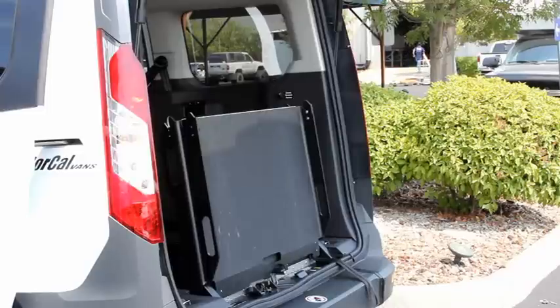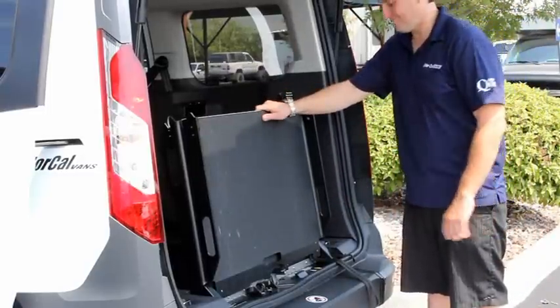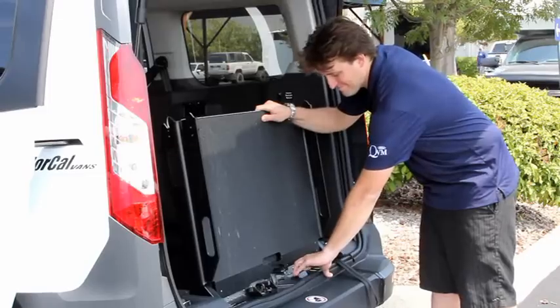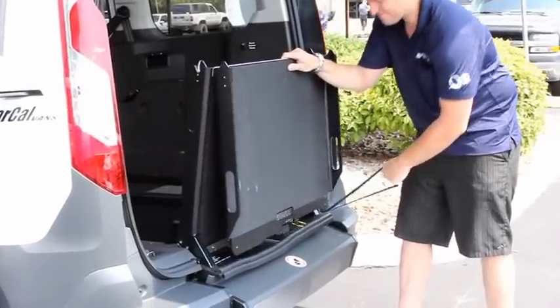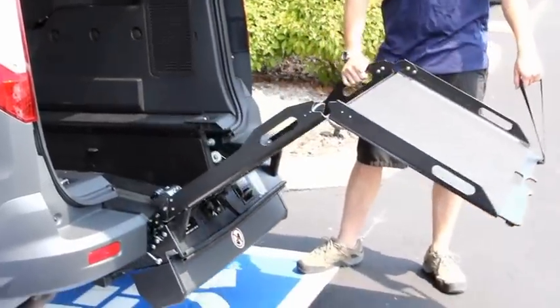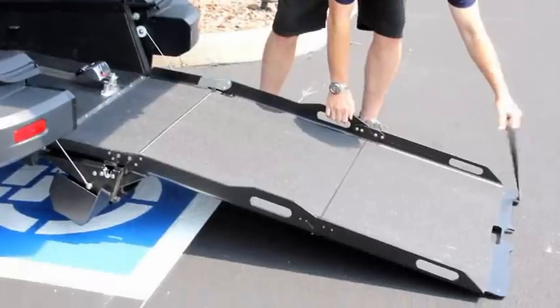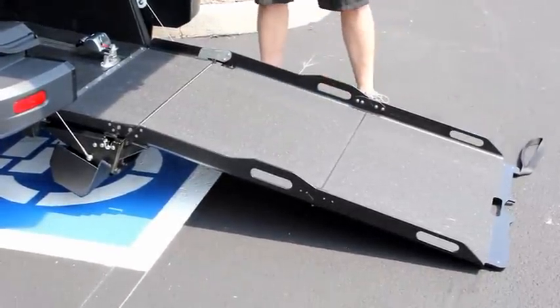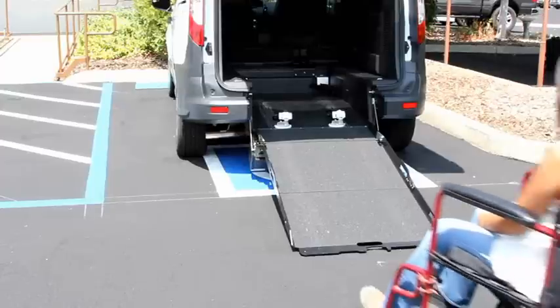To lower the ramp, stand on the passenger side of the vehicle where the strap is located. Hold the top of the ramp with your right hand. Use your left hand to pull the handle and lower the ramp slightly towards you. Grab the strap with your left hand and place your right hand in the upper grab handle of the ramp. Slowly and carefully lower the ramp, keeping your fingers clear of where the ramp side walls close. Ensure the ramp is fully deployed before boarding.